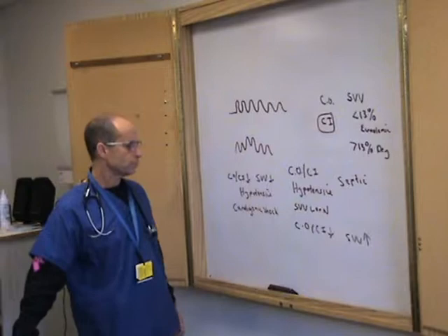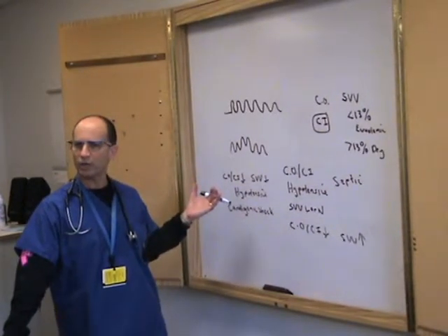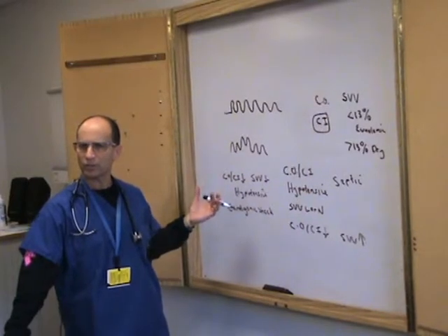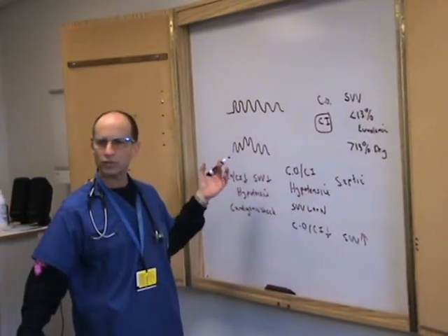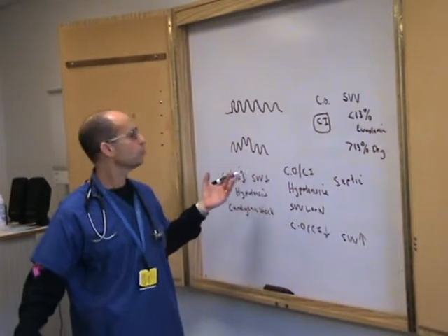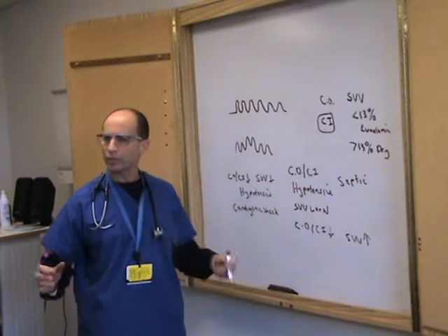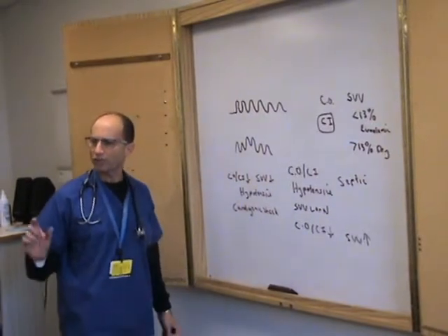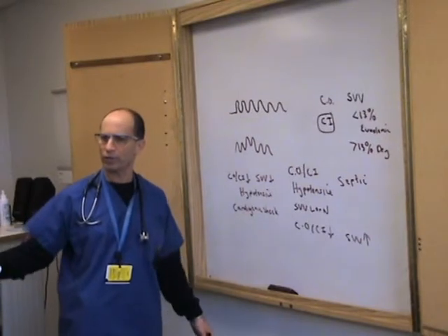Okay. The other thing that we tend to do is we supplement this with bedside echo, and we look at the IVC. I think when you combine this along with looking at the IVC, it helps you out quite a bit. So we go in the subcostal area, we look at the IVC. If the IVC is less than 1 centimeter, they're dry. If it's greater than 3, they probably have more than enough volume.